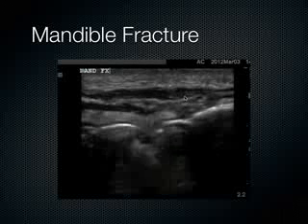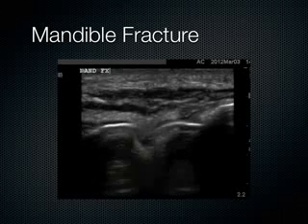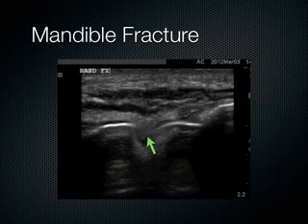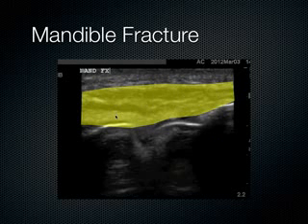All that material there. And this is a comminuted mandibular fracture, which means it's in different pieces, and the disrupted cortex is located at two different places there by those green arrows, and you can see accompanying superficial layering of the fluid from all that soft tissue swelling that's anterior to this whole process. So many times we see a lot of edema or even hematoma formation above these fracture patterns. One part of the bone of the mandible is here, and then there's a step off, and then there's another bone here, and then the other bony landmark is over here. So this is comminuted, broken in two different places.